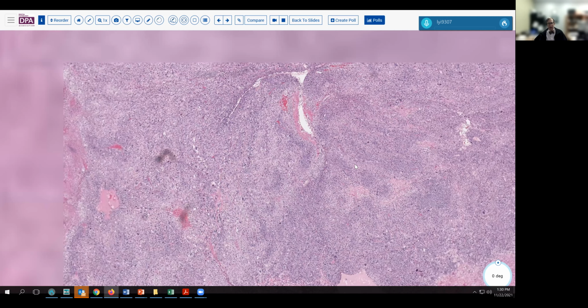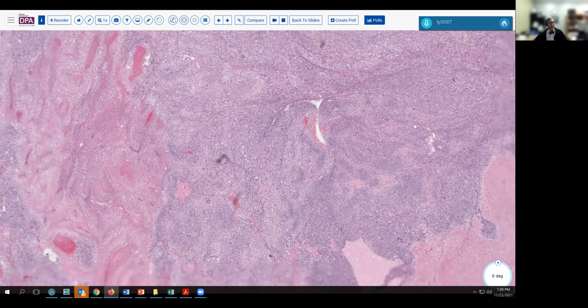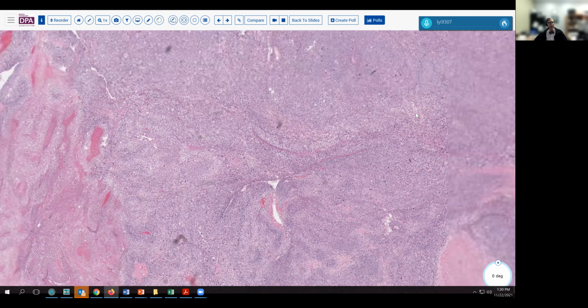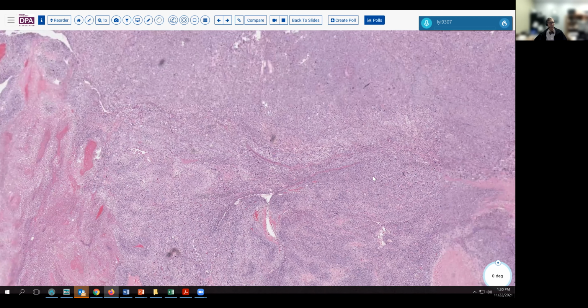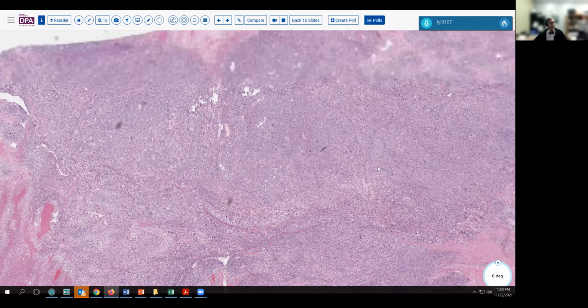These tumors tend to occur around the limb girdles, and they can occur at a wide array of age ranges, and they tend to be bulky, and as this case was, somewhat of a challenge for resection. So I'll go on here a little bit further, and we'll talk about another tumor that comes into the differential in soft tissue tumors.